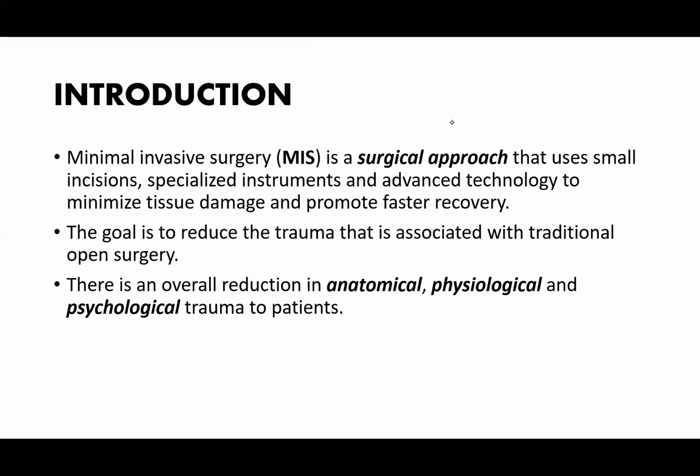Now, minimal invasive surgery is a surgical approach that uses small incisions, specialized instruments, and advanced technology to minimize tissue damage and promote a faster recovery. The goal for minimal invasive surgery is to reduce trauma that is associated with the traditional open surgery.